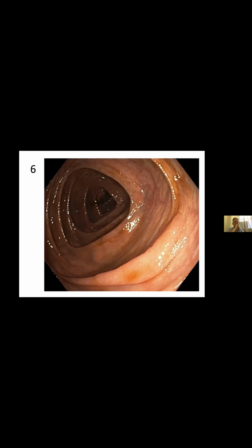Most people can see the big pedunculated polyp, but these lesions can be quite subtle. They often have mucus on top of them, which attracts a little bit of muck and stool, that's residual stool. So if you don't have a perfect prep, you're going to miss these lesions, specifically on the right side.